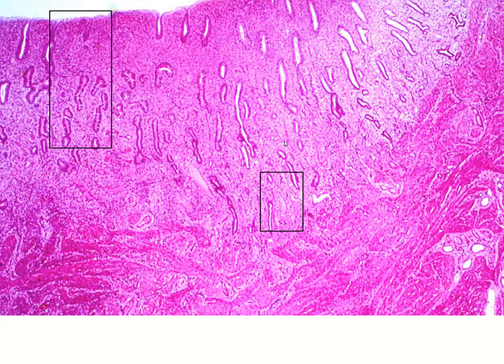Here we have a closer look. Again, we can see the smooth muscle of the myometrium curving around in this direction, and then the majority of these white spaces are going to be our uterine glands. As we look in other sections, we're going to begin to recognize our straight and spiraling arteries and veins that are present in the endometrium. The straight vessels will be near the basal portion, whereas the spiraling arteries will be closer towards the superficial, or definitely in the functionalis portion.